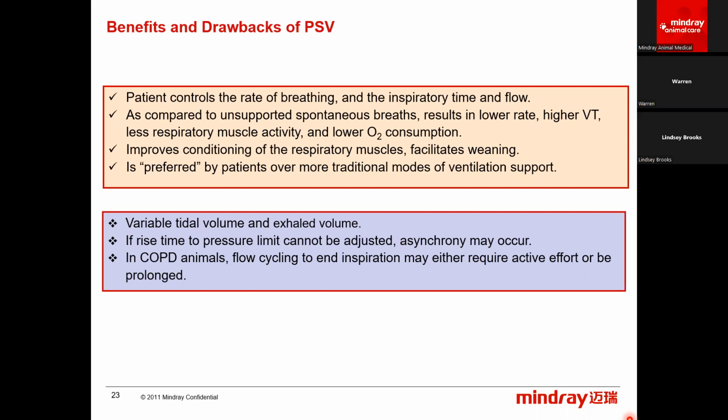And then for patients with obstructive disorders, flow cycling to end inspiration might create some difficulty because they're not able to exhale as efficiently. And so that exhalation phase might be prolonged.